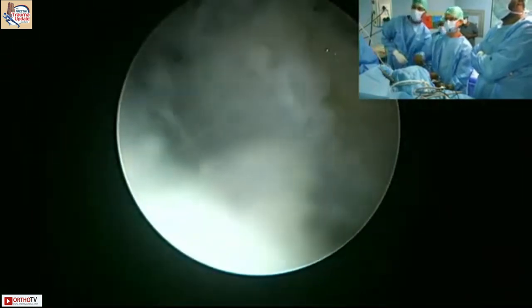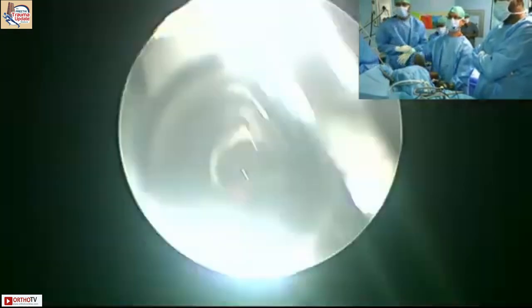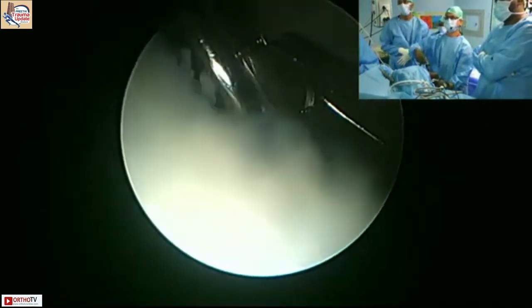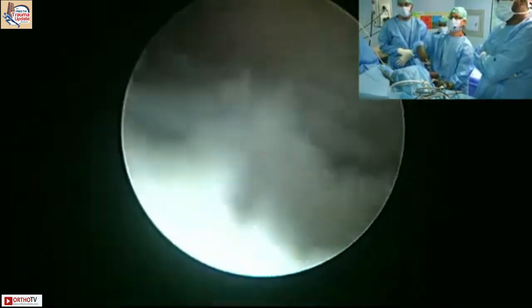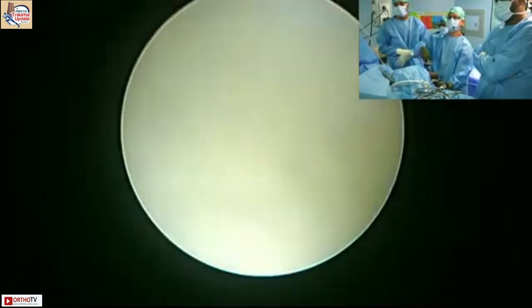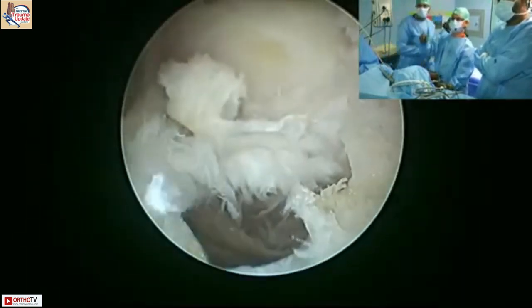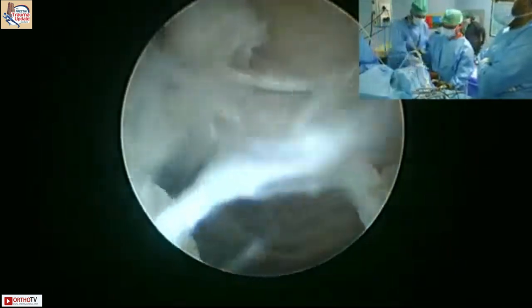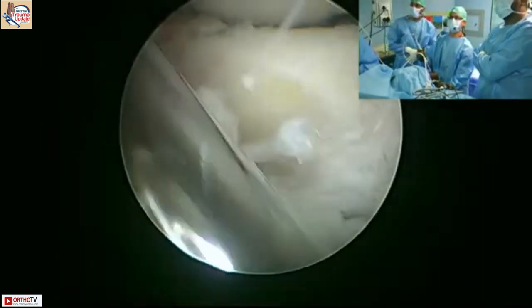I don't know, something's wrong. Hold on, don't touch the elbow, let it drop. If you move the elbow, my position moves. Okay, so I've just got that little piece left and I'll shave it off. Shaver, please. So you can see the anterior capsule is breached. So now there's no point in doing too much here.